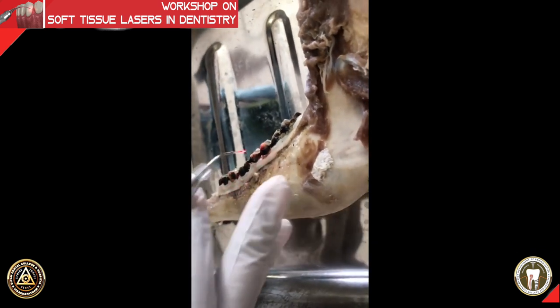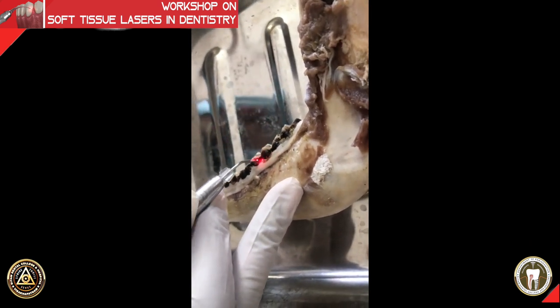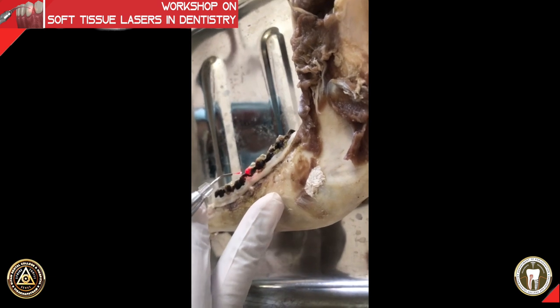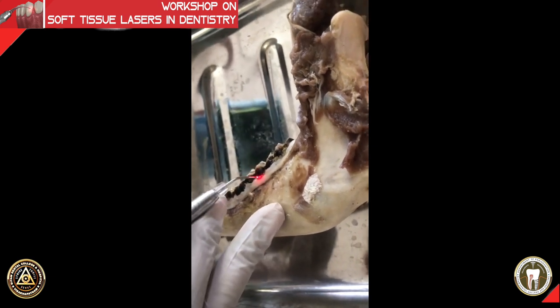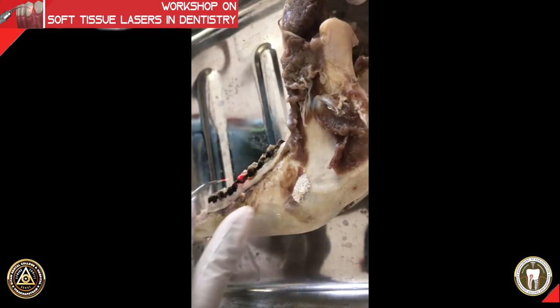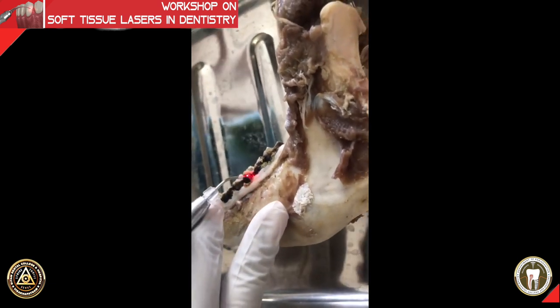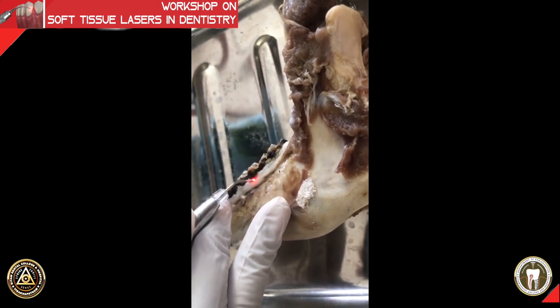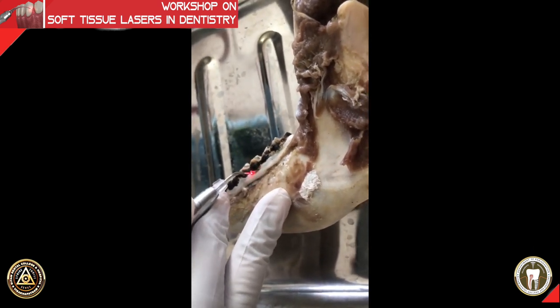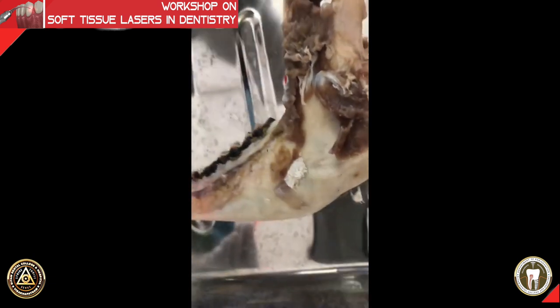Give one incision and repeat the incision again in the same spot — that is called layer cutting. Don't try to chop off the tissue in one shot; it doesn't help at all. Do one incision and repeat it. That is the correct way of increasing crown height by gingivectomy.